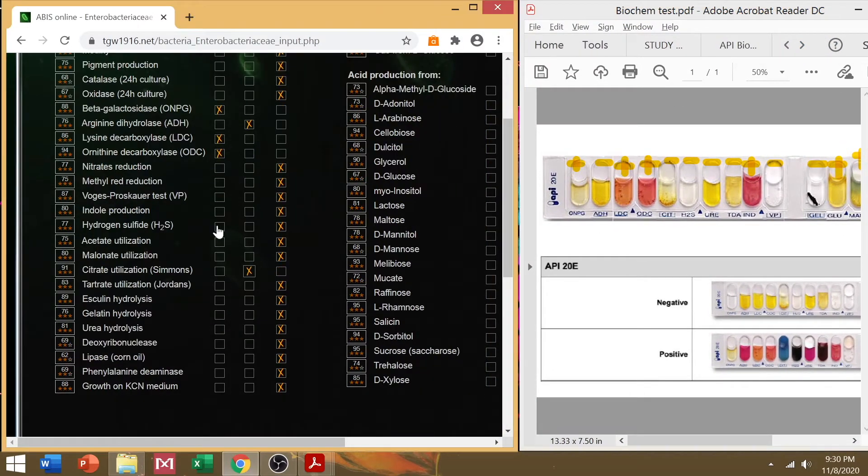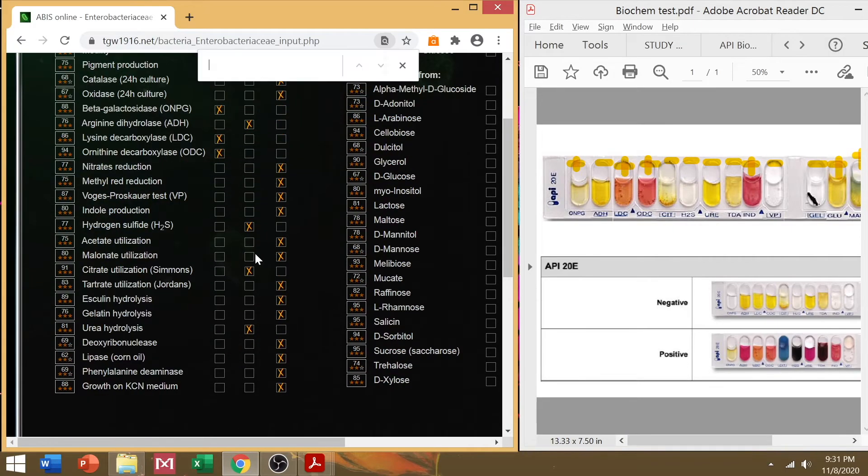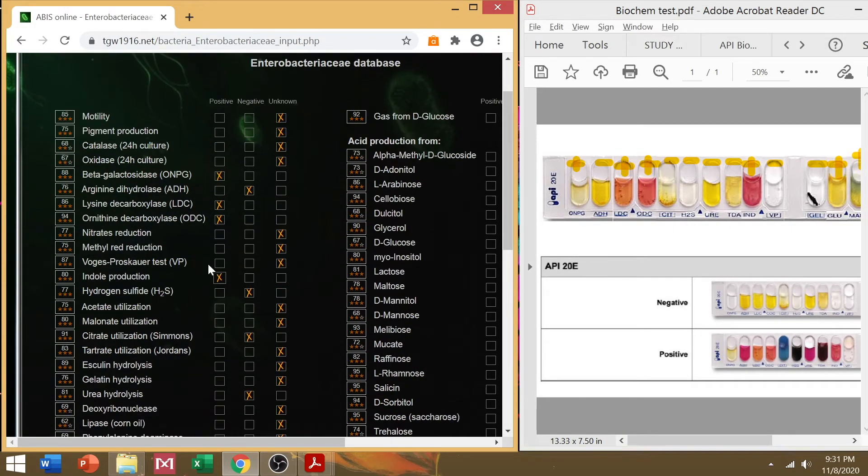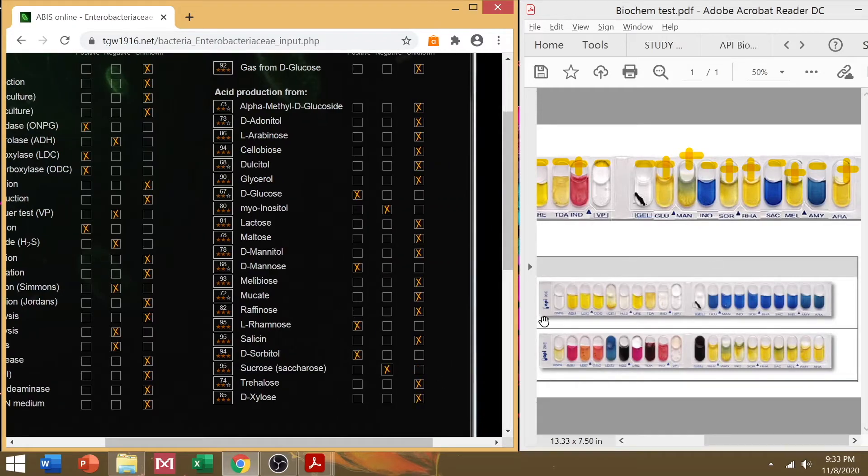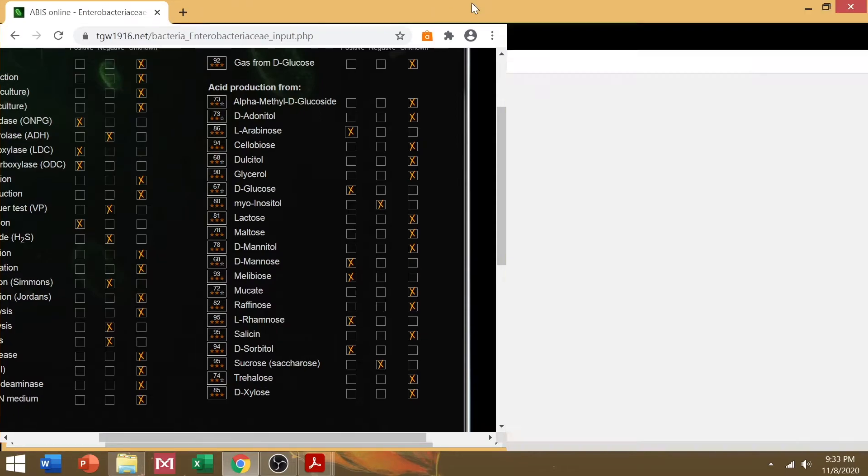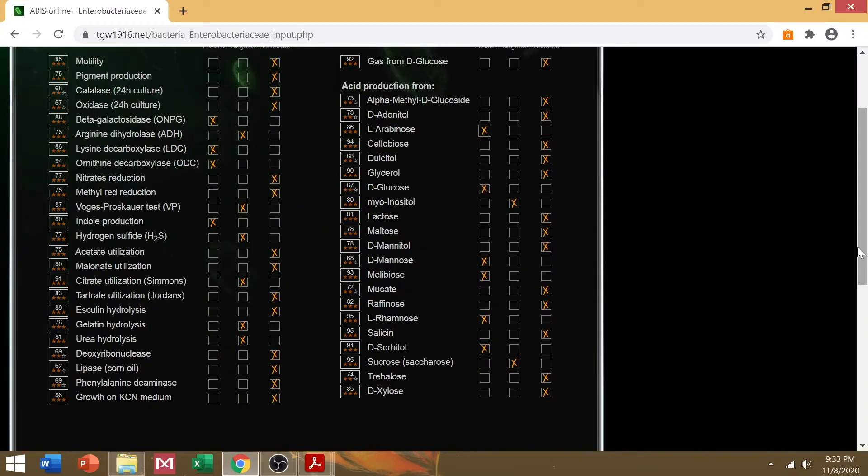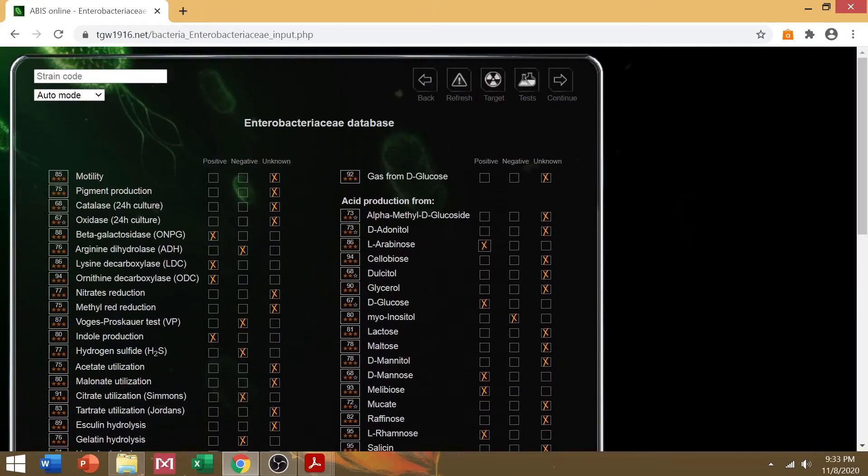So if it's positive, tick positive. If it's negative, tick negative on the reaction in the ABIS online database. So after ticking them, I sped up the ticking process. Click continue.